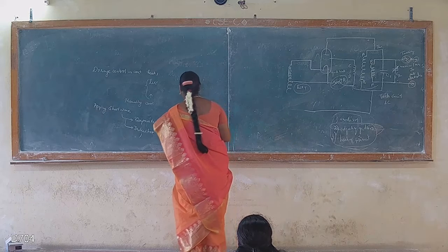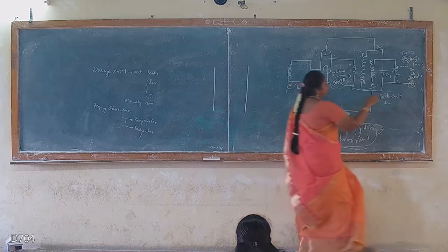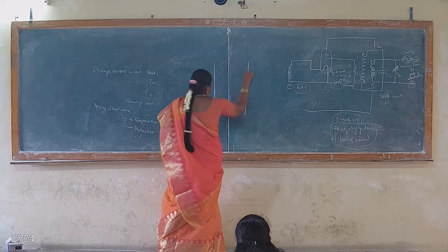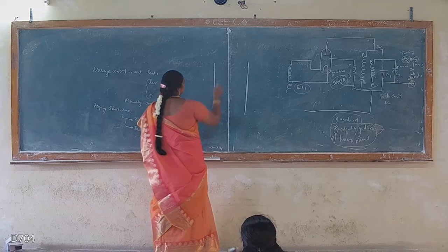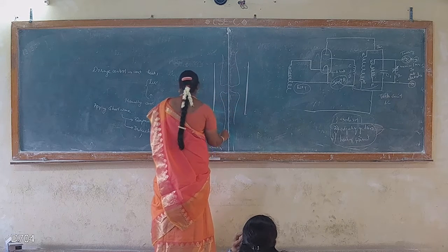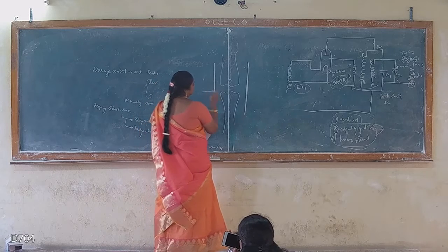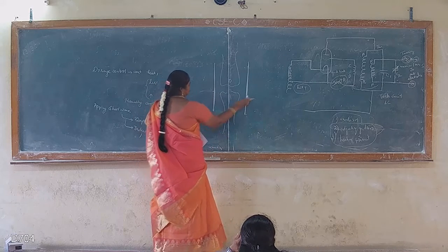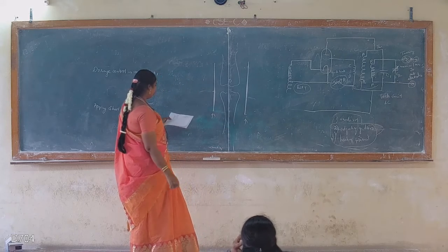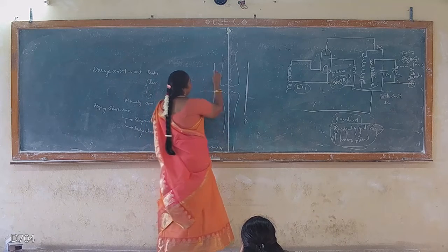In the case of the capacitor method, the two electrodes, which means these two points driven from this circuit, are connected to metal plates only. Now this is the area to be treated. Say this is the bone, this is the area to be treated. So now what will happen? These are the two electrode points. When we place them on either side of the area to be treated, now what will happen?